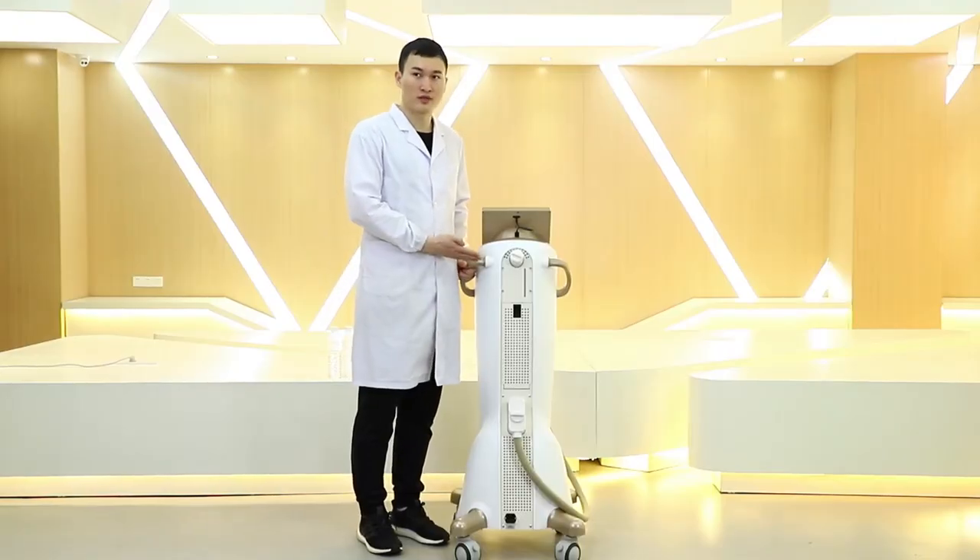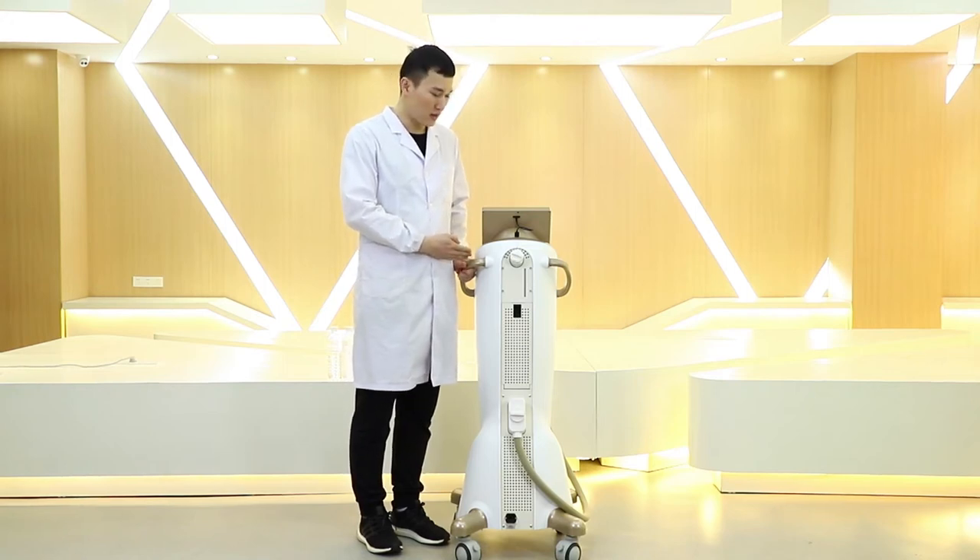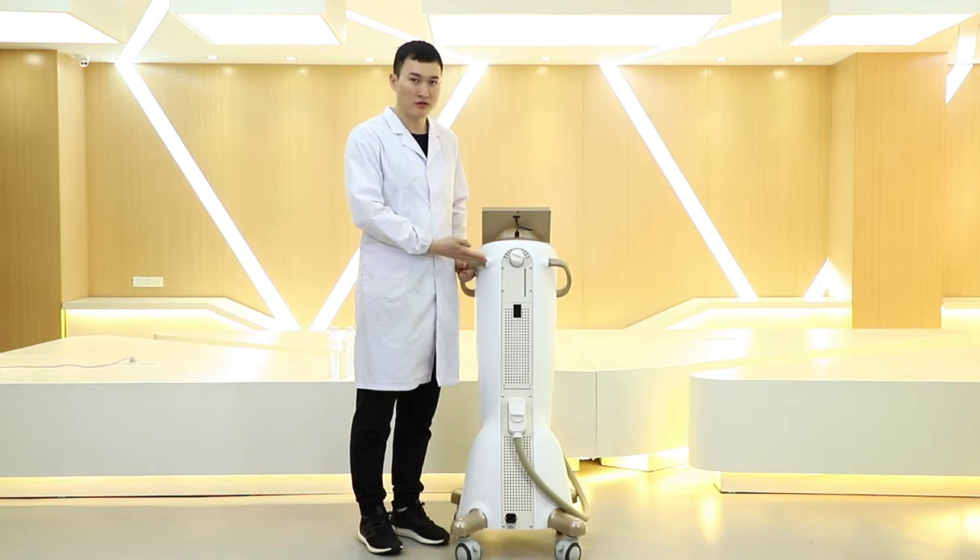As we need water to cool down the laser generator, this machine must have water added before running. Now we will show how to add water.